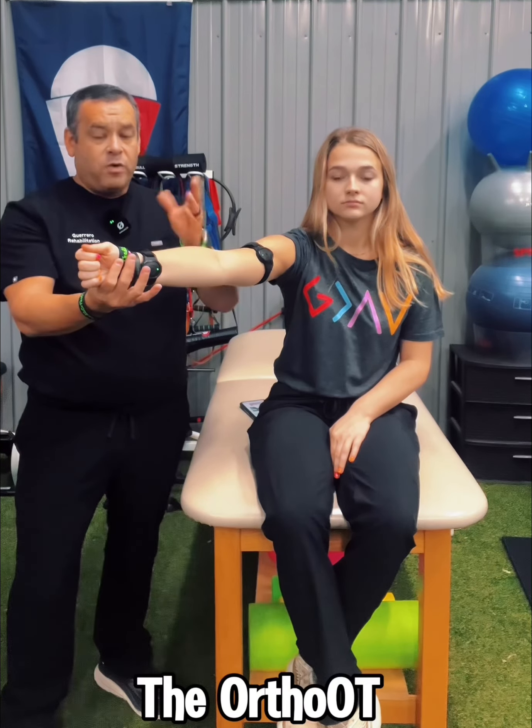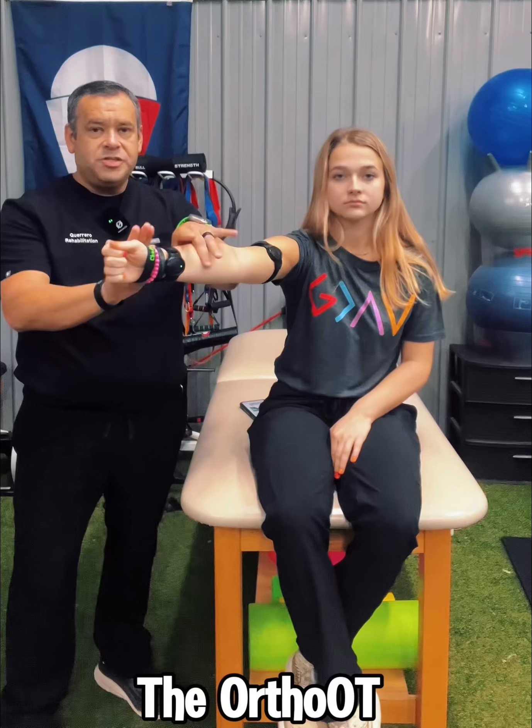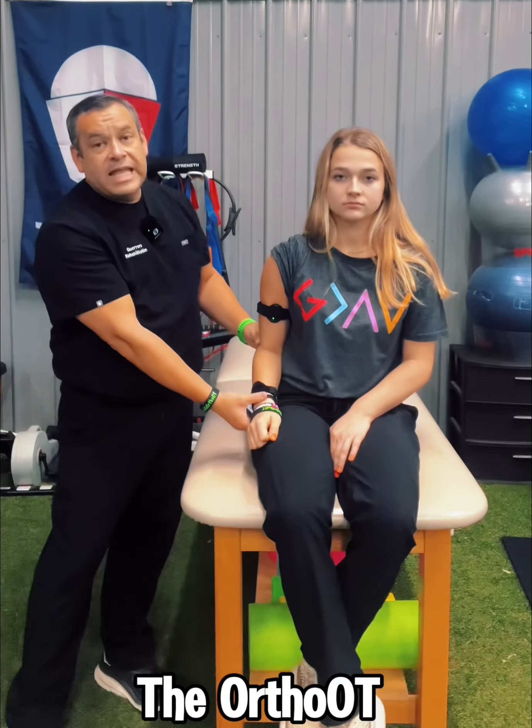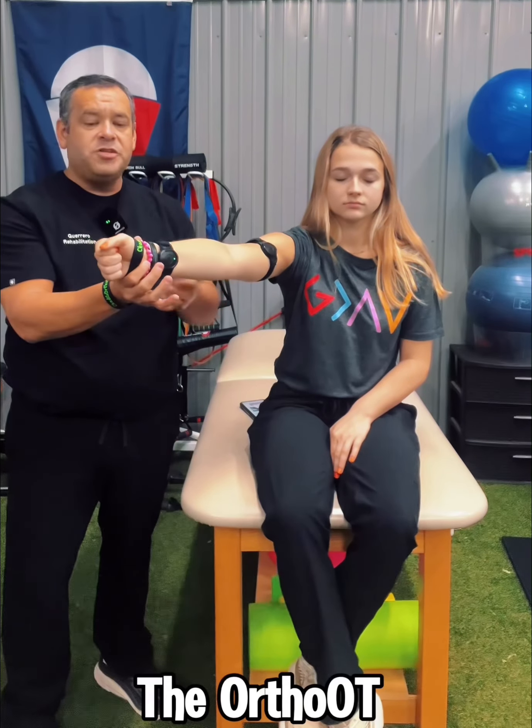Just to give an example of one movement: I'm going to bring her arm out right here in the plane of what's called scaption and hold it there. While she holds it there, she's going to resist me — a little bit of perturbations, a little movement — and then relax. We're going to bring it down.